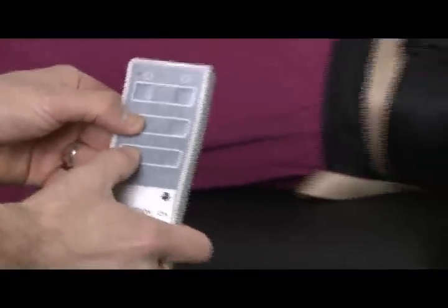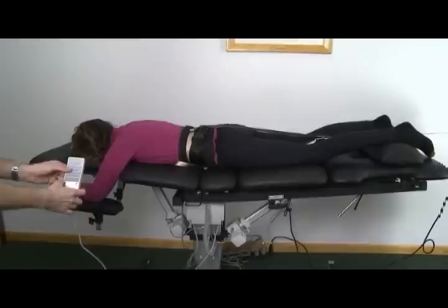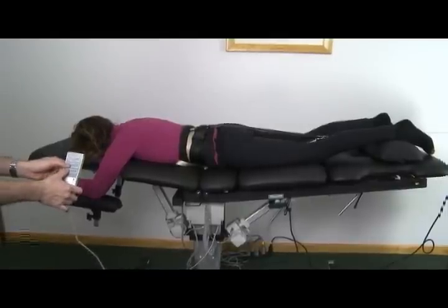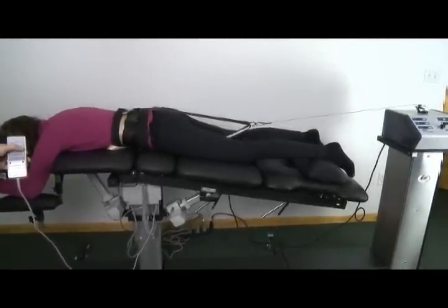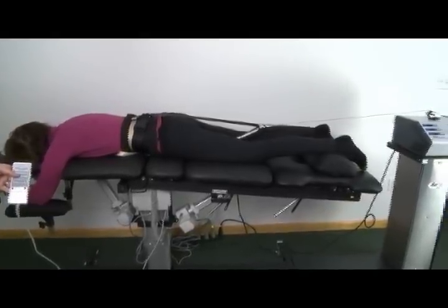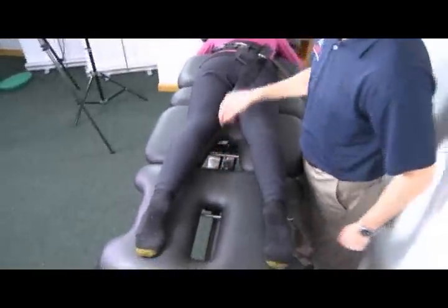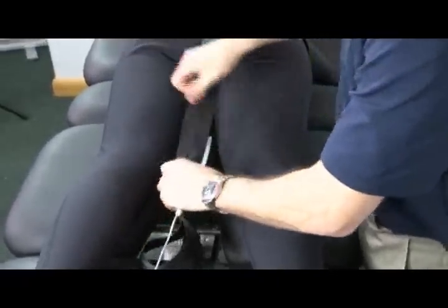To place the patient's lower torso into extension, hyperextension, or lumbar flexion, utilize the appropriate switches on the hand controller to create the positioning. There is a level at the base of each side of the table which will assist you in returning the table to a level position. When placing a patient in flexion, it may be appropriate in certain male patients to engage the belt clip which keeps the lower belt loop from creating pressure to the patient from the lower strap when the table is fully flexed.